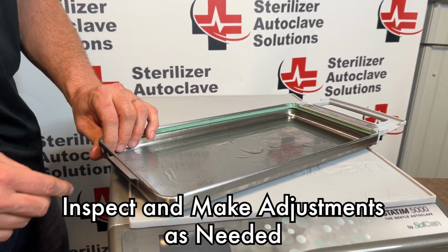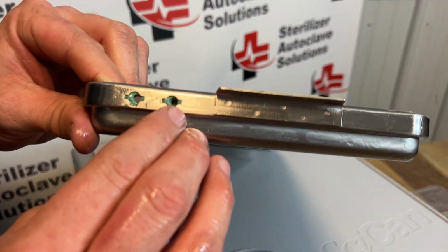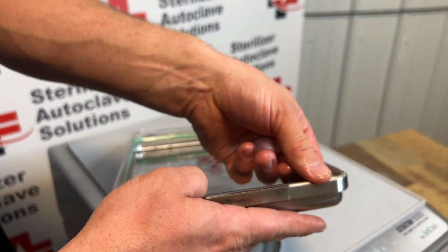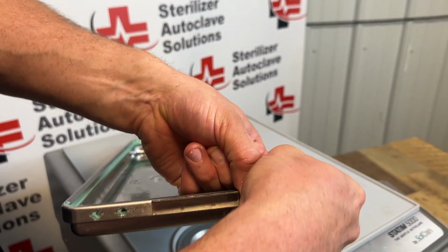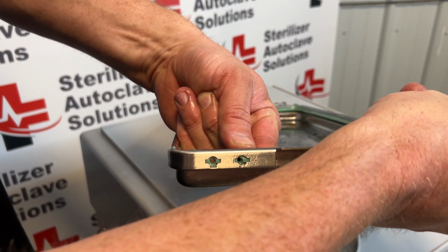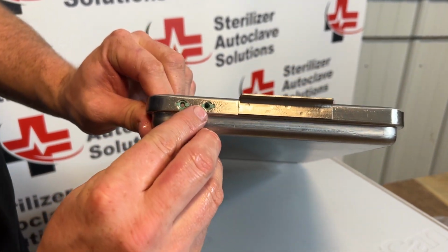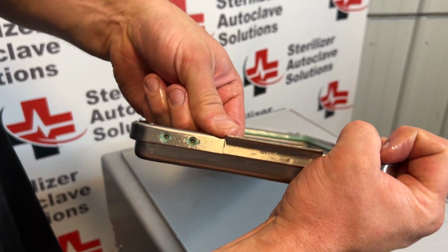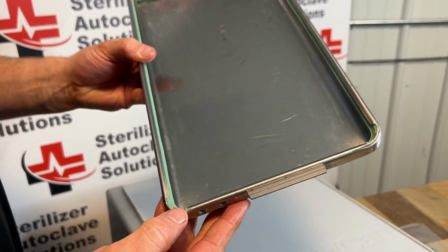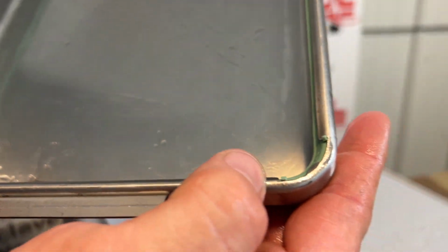When you've gone all the way around, we want to inspect the back. As we see, we are not completely lined up. We are too far off to one side. So I'm going to take my finger, put it back in that groove, and pressing in and pushing up, I'm actually going to slide the seal into place. These square blocks should fill those cavities. Went a little too far, and it will set. We want to inspect and make sure that all those nubs are in the corners.